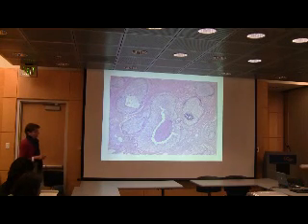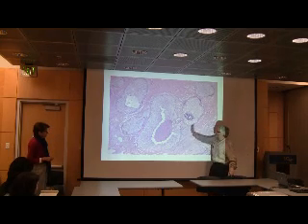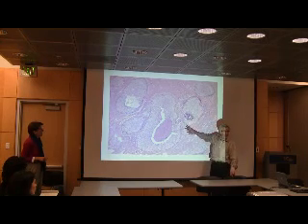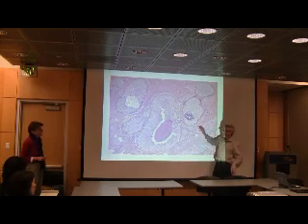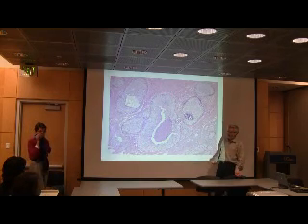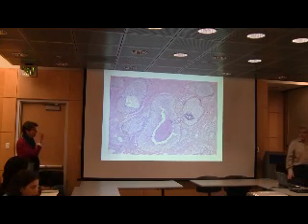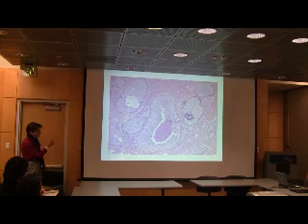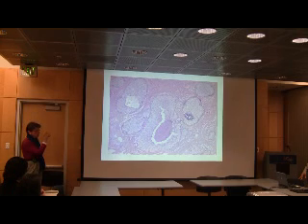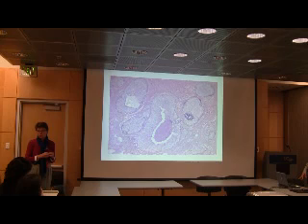This is ductal carcinoma in situ, right, because Britt's going to get there in a moment, but the basement membrane surrounds these ducts, and these cells are not breaking through. It's all unbroken. You can't see any tumor cells outside the ducts themselves. So that's the definition of carcinoma in situ. So there's no invasive. And when you're at this stage, the tumor has not yet developed the capacity to metastasize. If it's all contained within the duct, it's still in situ. It's right there. It hasn't gone.